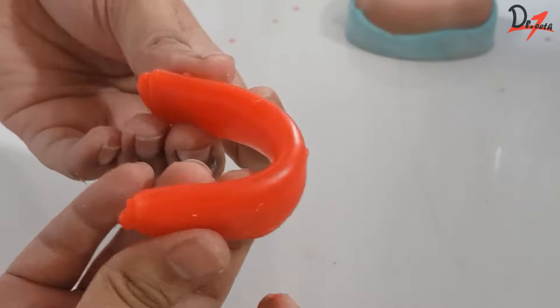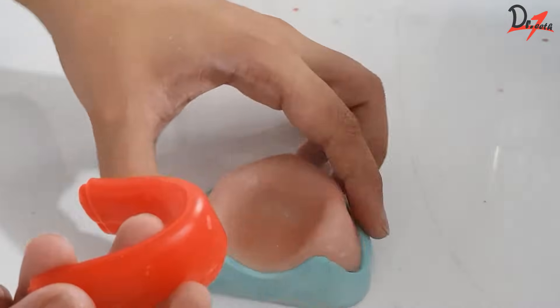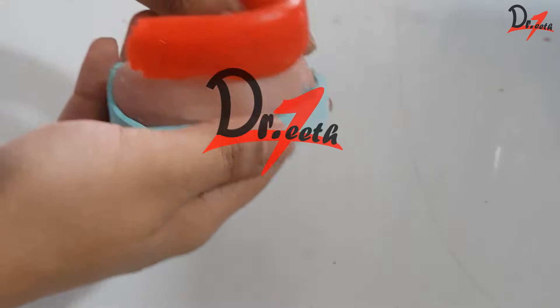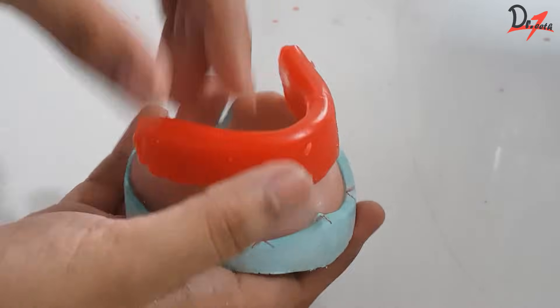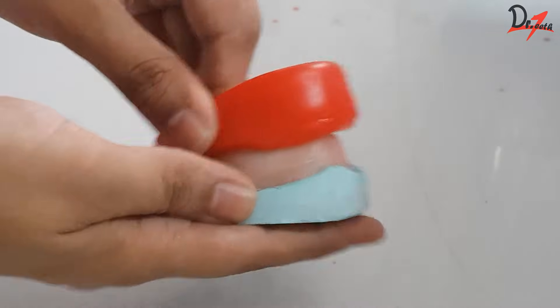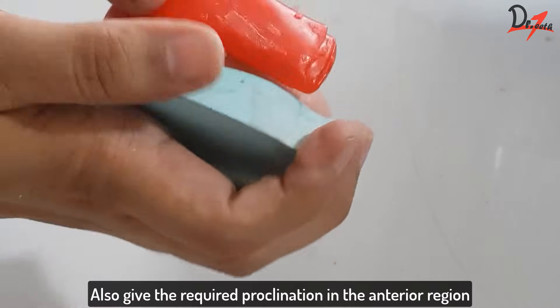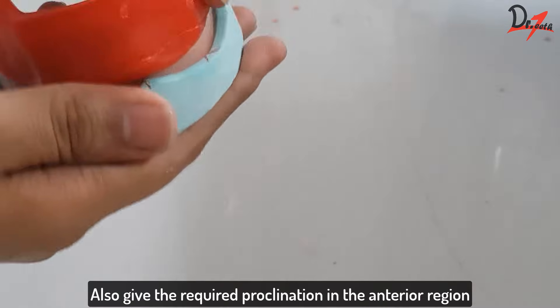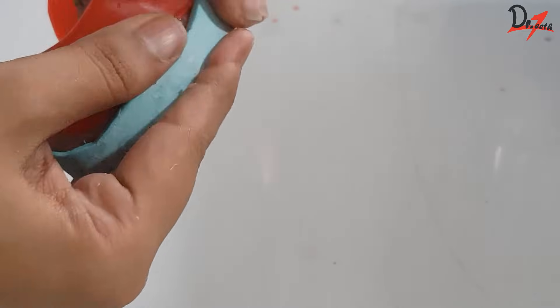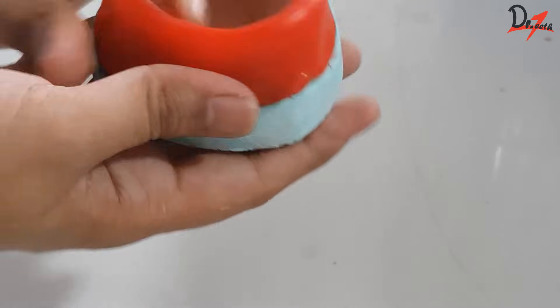Once we're done with the folding, we will make a U-shape mimicking the arch form and keep it on our cast. Align it according to the arch form, and then I'm going to push the rim to cover the facial aspect — I'm doing this while the rim is still warm so that it is moldable. We can adjust the shape of it later, don't worry about that.